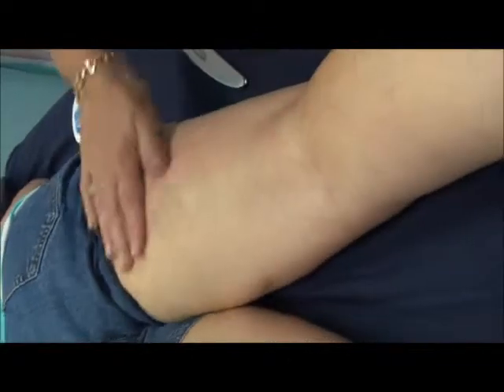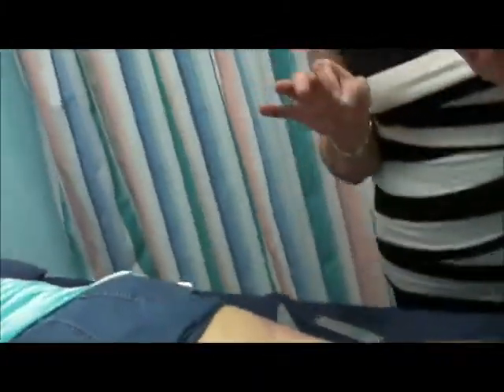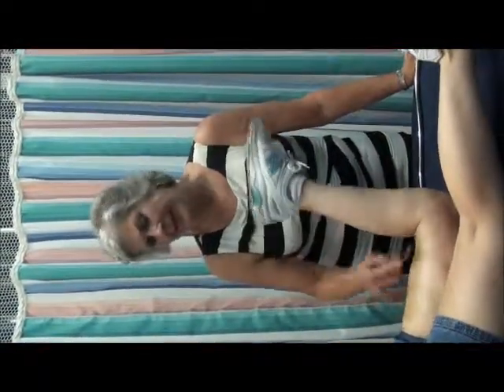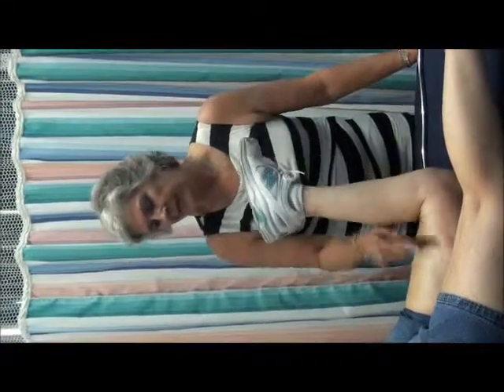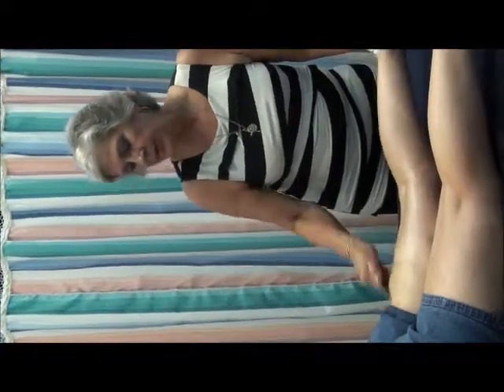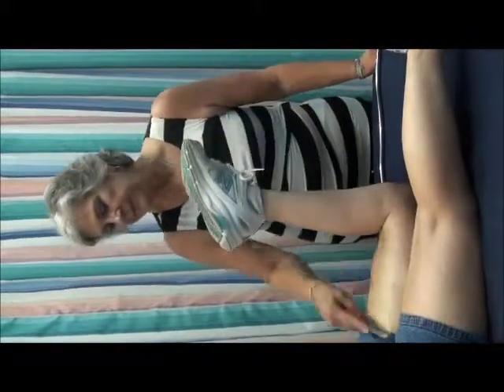Okay. Next, I do a dynamic approach to get the muscle fibers that have scarred in the process of muscle contraction. When a muscle contracts, not only does it shorten, but it also widens, and it's in the widening that we want to break up the scar. So I have her bend her knee, and then I have her straighten it. And I do it in both an upward and a downward movement. Continue to bend it for me, Corinne.